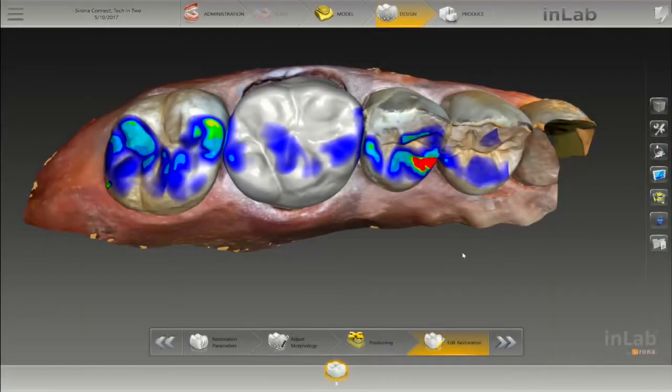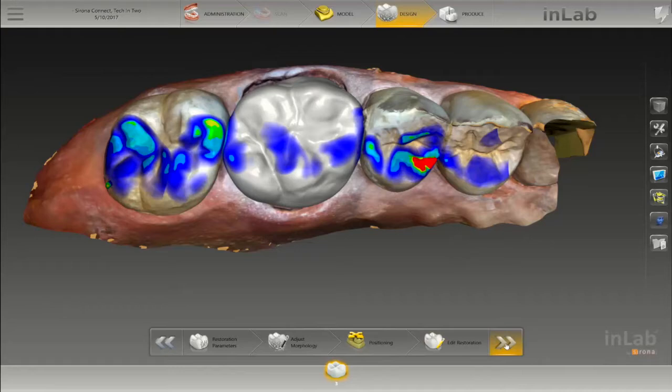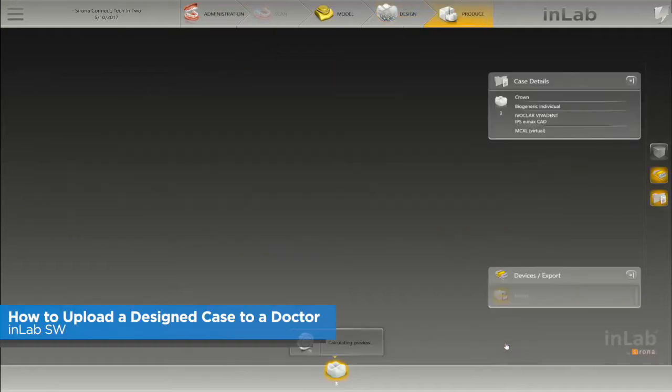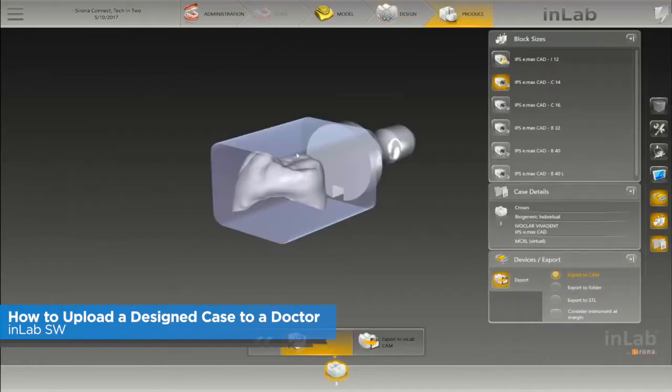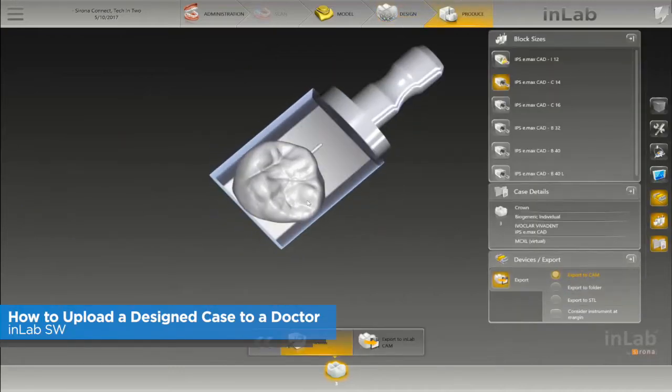Hey this is Frankie with Tech In Two. In this video I'm going to show you how to design a case and upload it back to the doctor so they can mill.